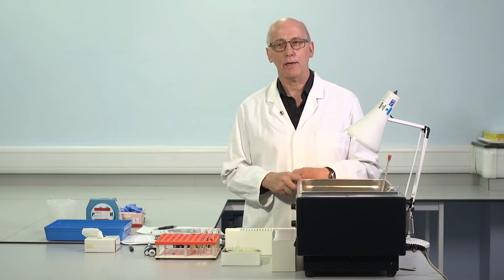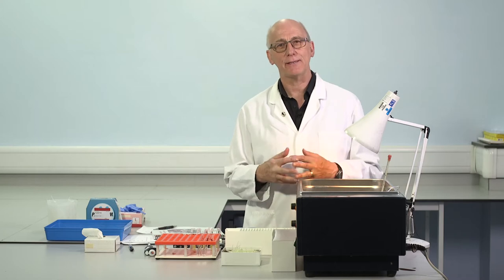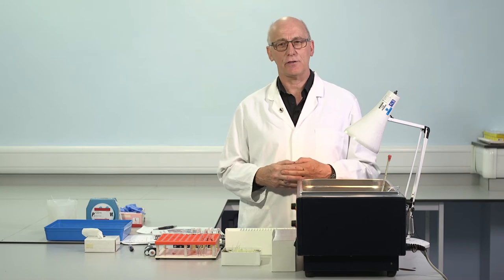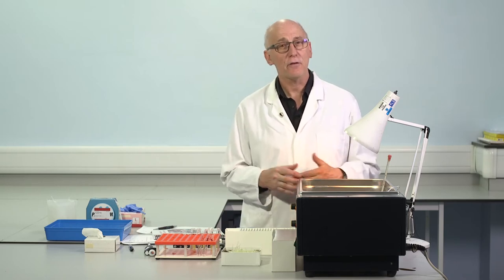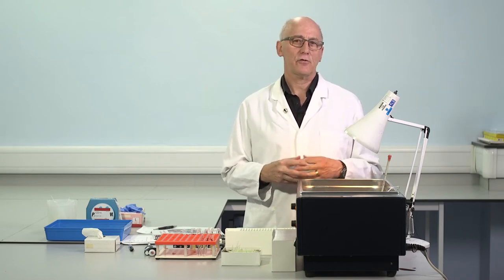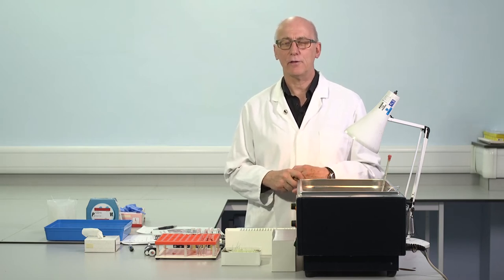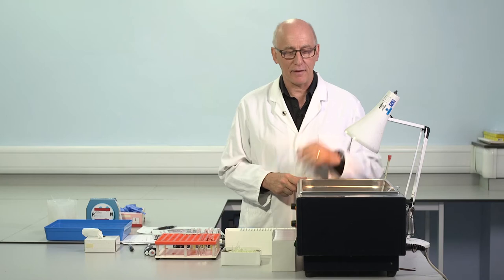In the UK, for example, we have the Human Tissue Act, which permits the use of residual plasma. When we've completed our diagnostic testing, any residual plasma we're allowed to make use of for quality control purposes. And that's particularly useful because it means we can harvest residual samples, plasmas, from patients, and we can use this to construct control materials. And I think there are a number of advantages to this. An obvious one is cost, of course. But I think in addition to that, such a sample, because it's a patient material, it's closer in its properties to patient samples. And I'm sure that's an advantage, because it's difficult to keep control materials with the same properties when we have to go through freeze-drying lyophilization. So I think there are a number of advantages.